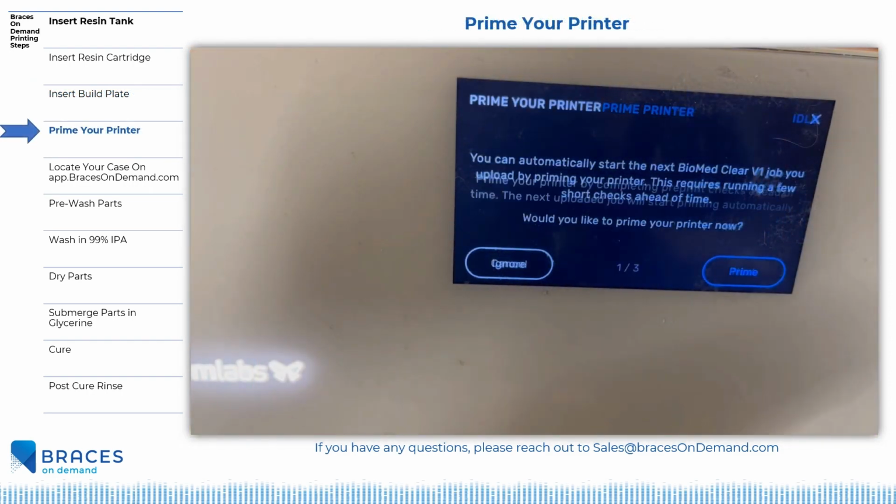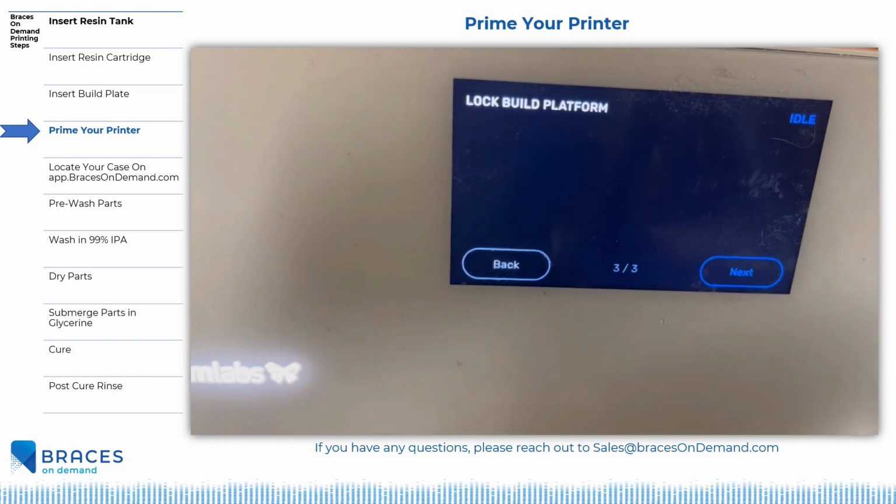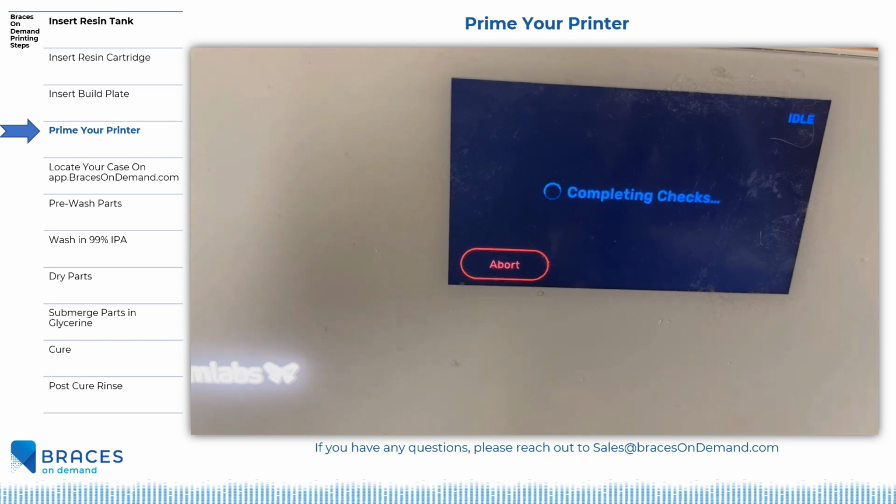Priming your printer is easy. Follow the steps on your display. The display will inform you if any of the previous steps were not performed properly.